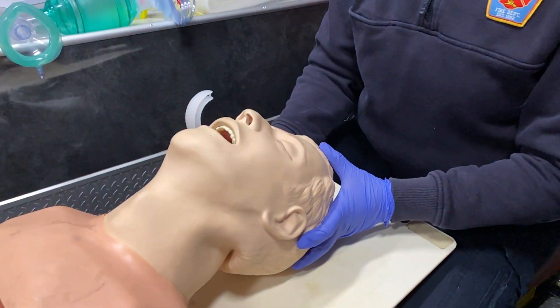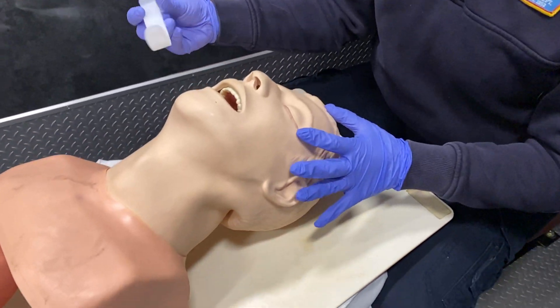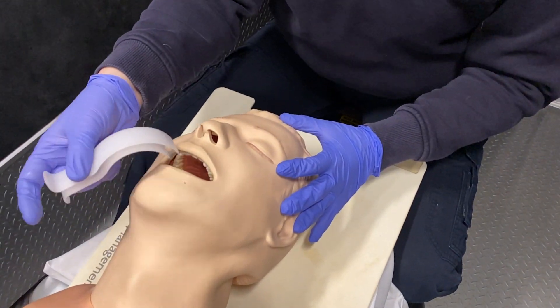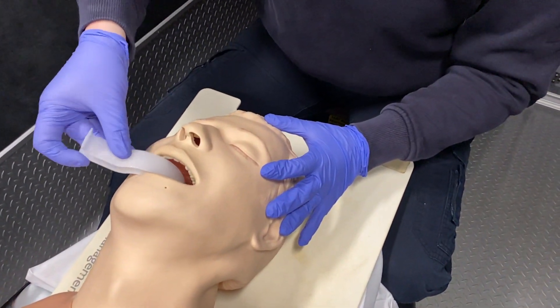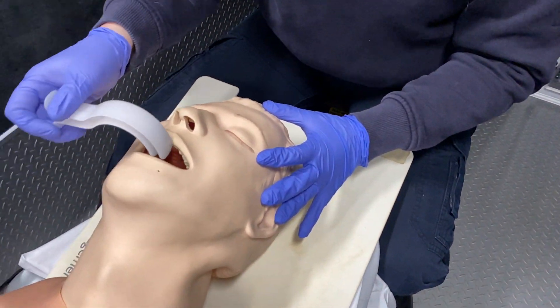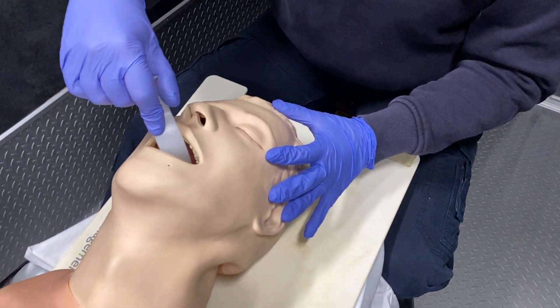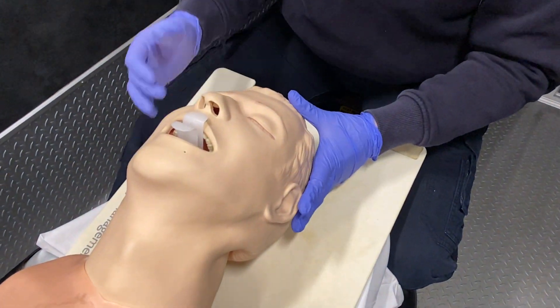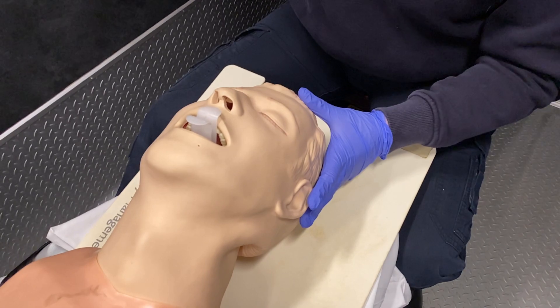When inserting the oral airway, extend the head back with a head-tilt chin-lift. You can go straight in using a tongue depressor, or insert at a 90-degree angle. Avoid doing a 180-degree rotation, as that can cause damage to the hard palate and soft palate of the roof of the mouth.